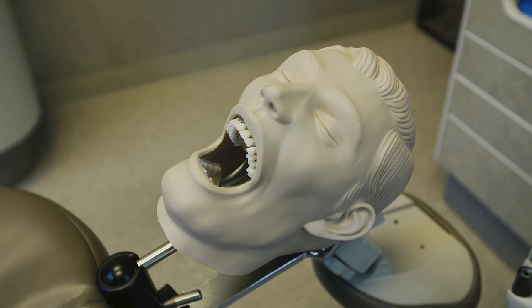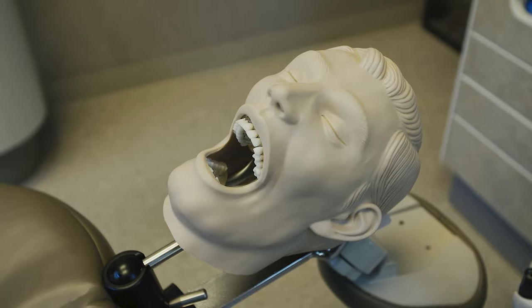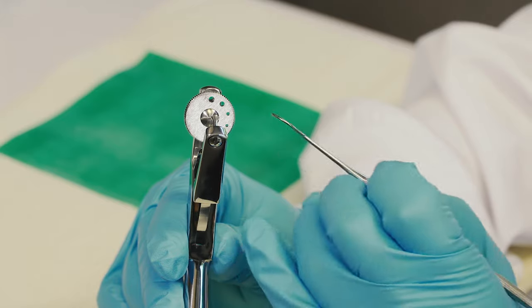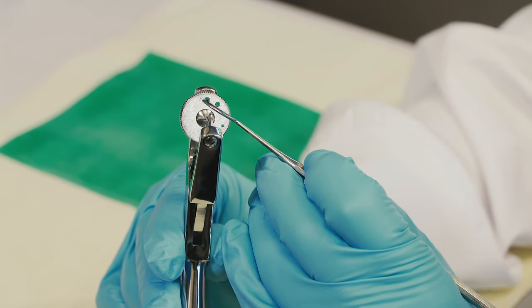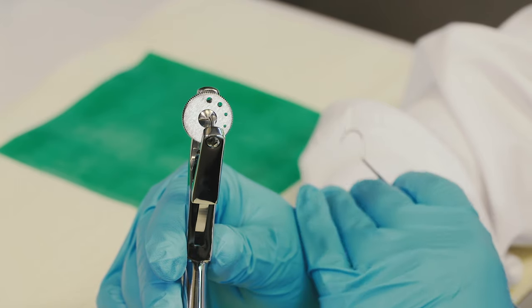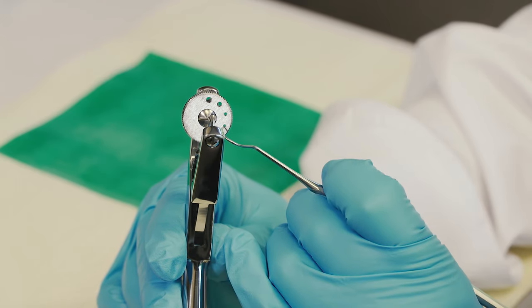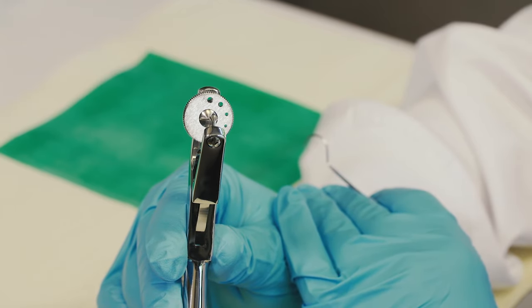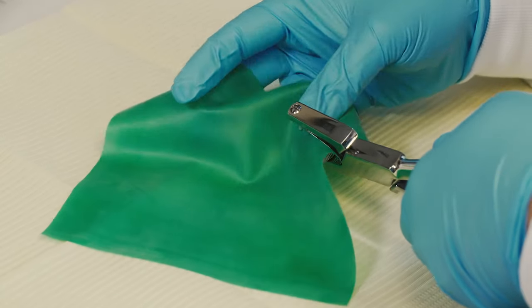When it comes to perforating our rubber dam using the Ainsworth rubber dam punch, I recommend selecting only three sizes of punch holes: the largest for the retentive clamp, the second to the largest for every molar, and the second to the smallest for every premolar or anterior tooth.